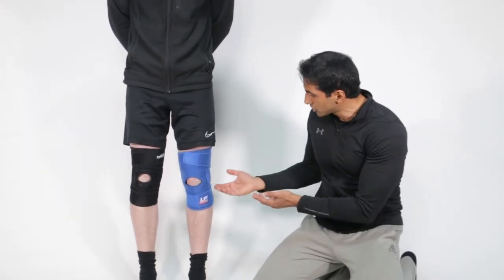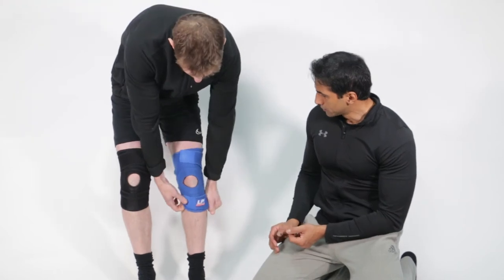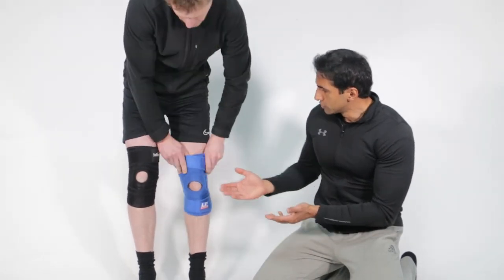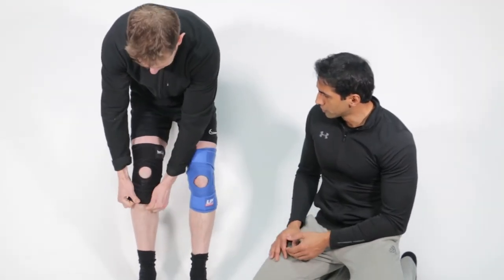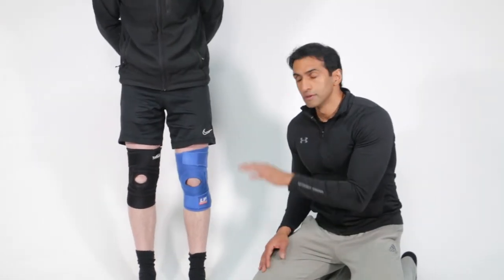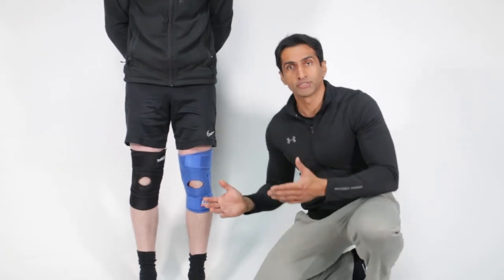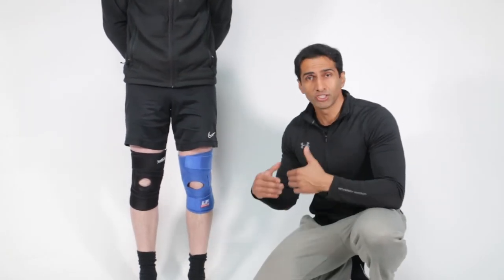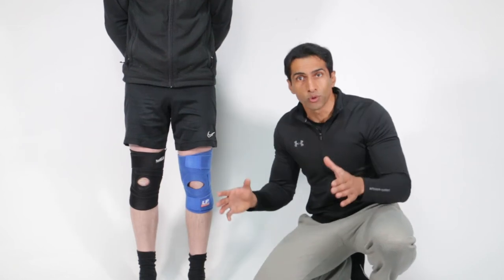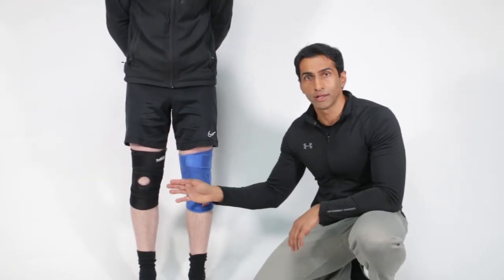Paul, just give that a little tug and see how that feels from the bottom. How does that feel — does it feel a bit looser? Yeah, it's coming off quite easily. Now do the same for the other one. That's not really moving much. It's not going to move because it has a patented four-strap system that really does give as close to a non-slip fit as possible. Obviously it can't be perfect for everyone due to anatomy and physiology, but compared to a three-strap system, it's just not going to fall down.